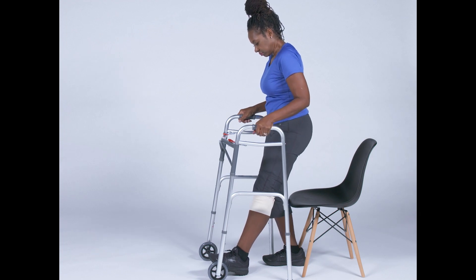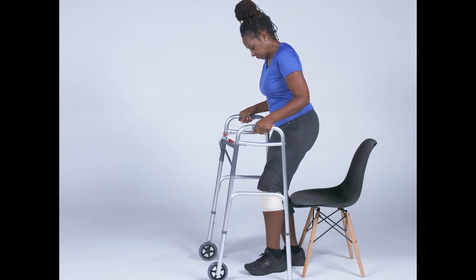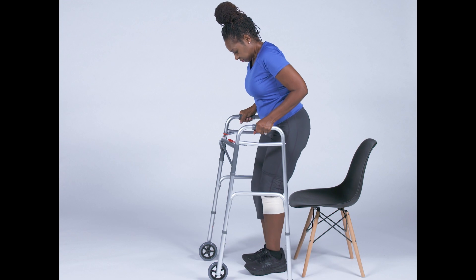When you come to a standing position, grab the walker with your other hand and bring both feet underneath you.